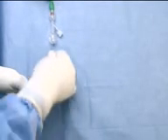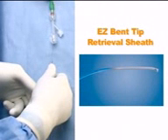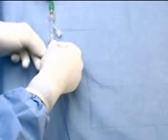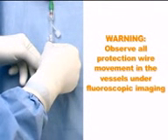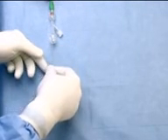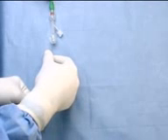If it is difficult to advance the EZ retrieval sheath through the deployed stent, try the EZ bent tip retrieval sheath. Secure the retrieval sheath and pull the protection wire proximally until resistance is felt. Under fluoroscopy, check to ensure the distal edge of the collapsed filter loop is even with or proximal to the retrieval sheath marker band. After successfully capturing the filter, retract and remove the sheath and protection wire slowly as one unit.